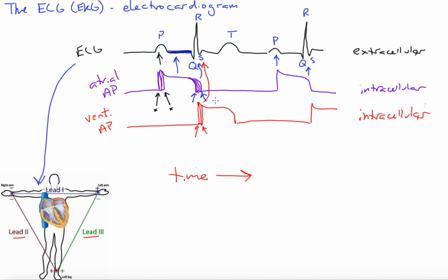Okay. Now, all of the ventricular cells would be depolarized at the same time. Check it out. Another isoelectric line. Right, same charge. Everybody's depolarized, so it's flat. Does it mean that the heart's doing nothing? No, it doesn't. It's electrically in the same state across the heart because everything's depolarized. It's not changing, I should say. Everybody's at the same state. They're all depolarized. However, that also means that the ventricular cells are contracting.